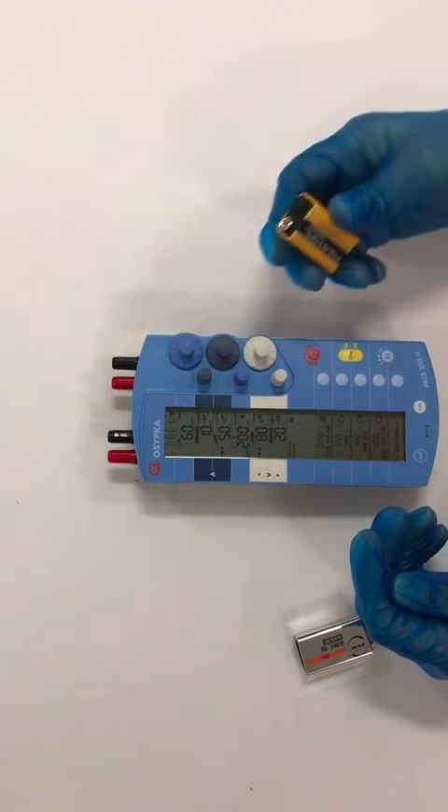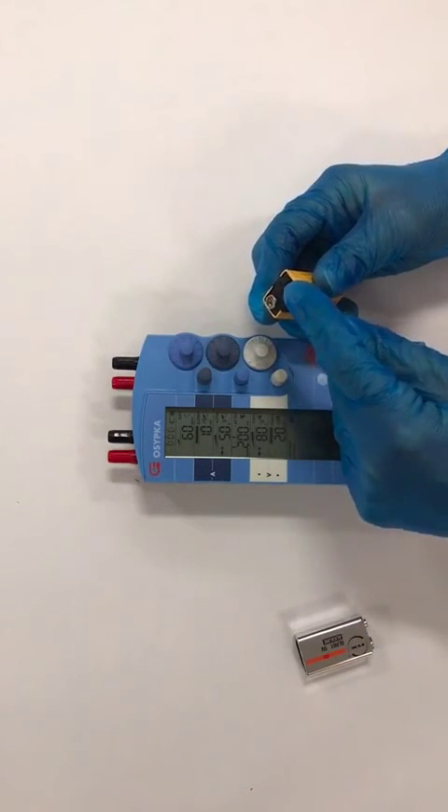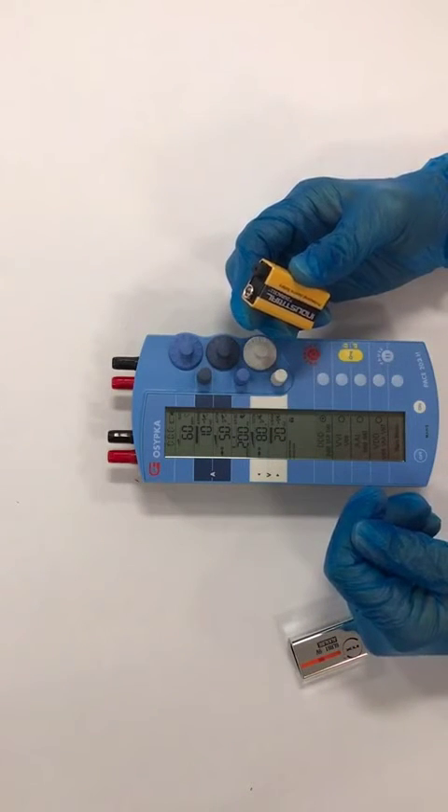Just be aware that some batteries have a black cap which needs to be removed, and some batteries come wrapped in cellophane — the cellophane has to be removed.